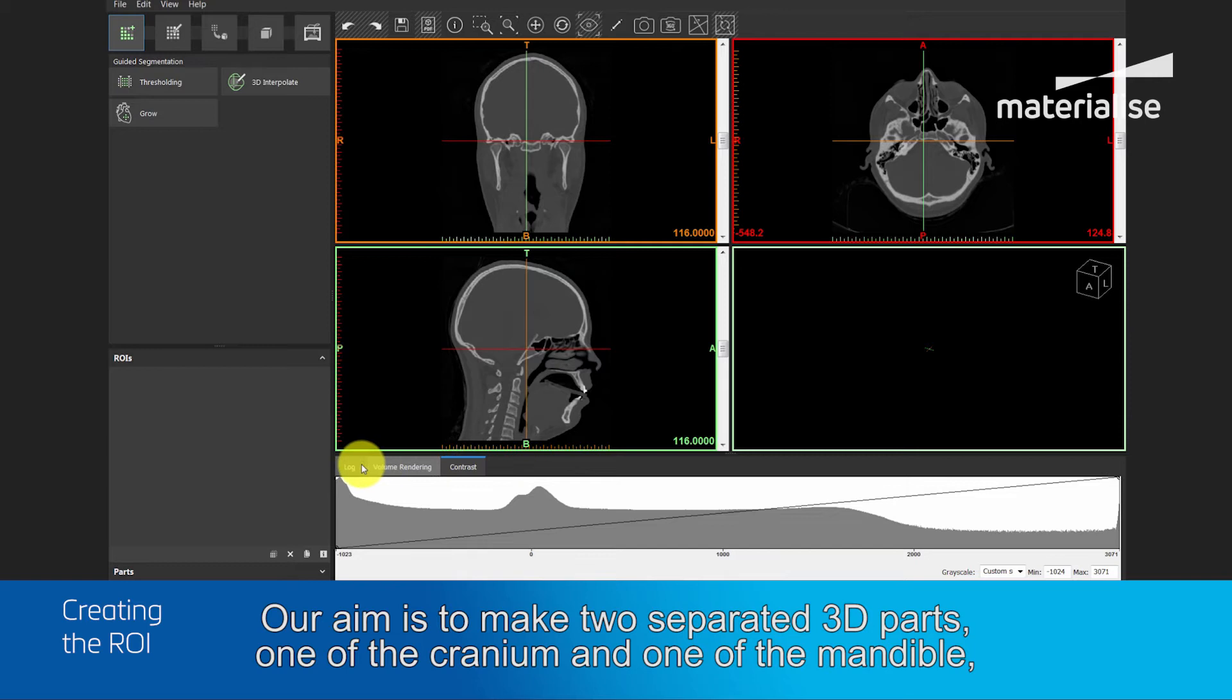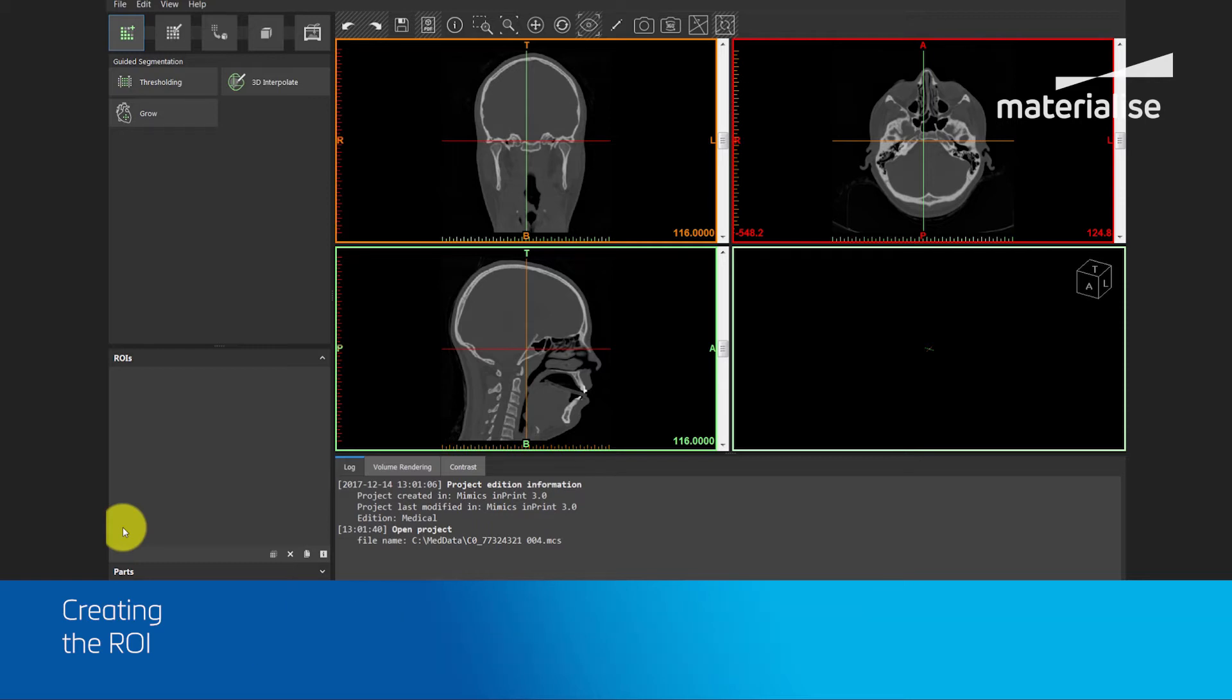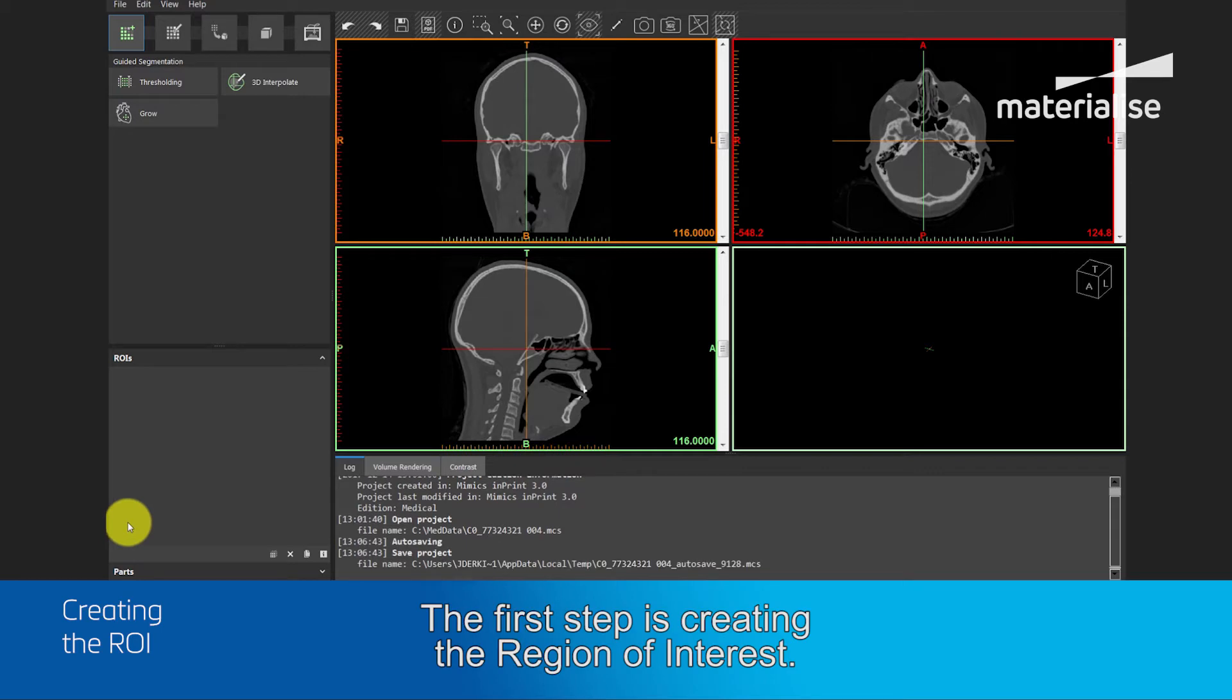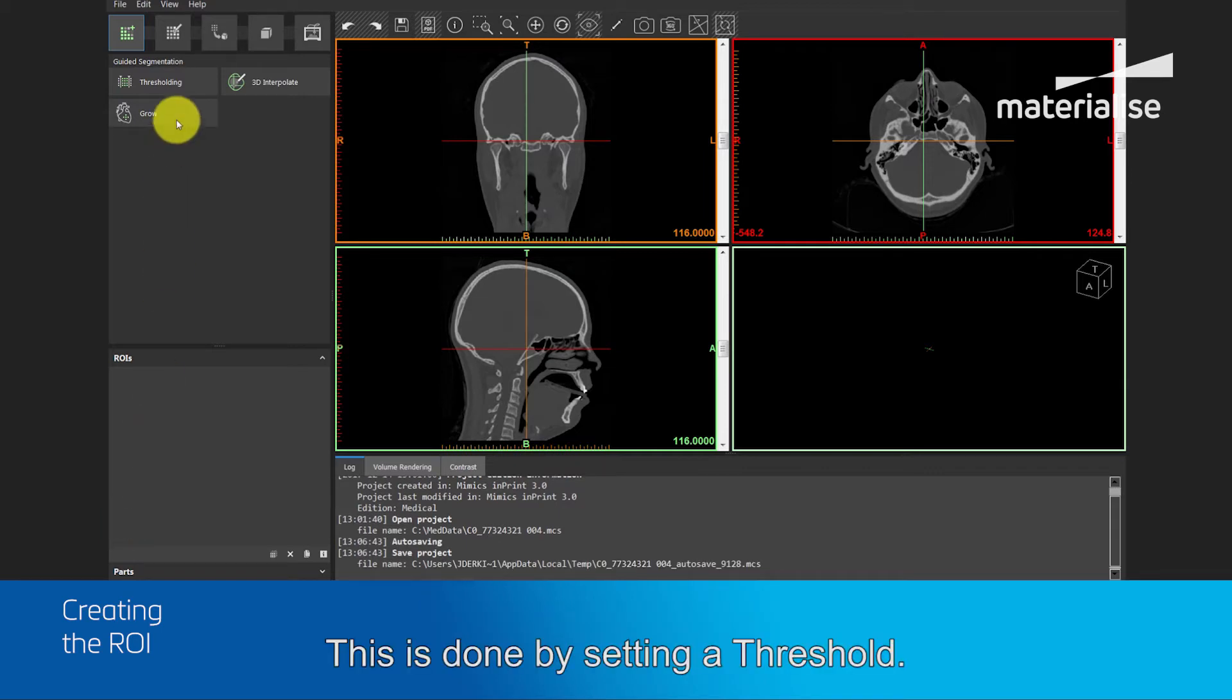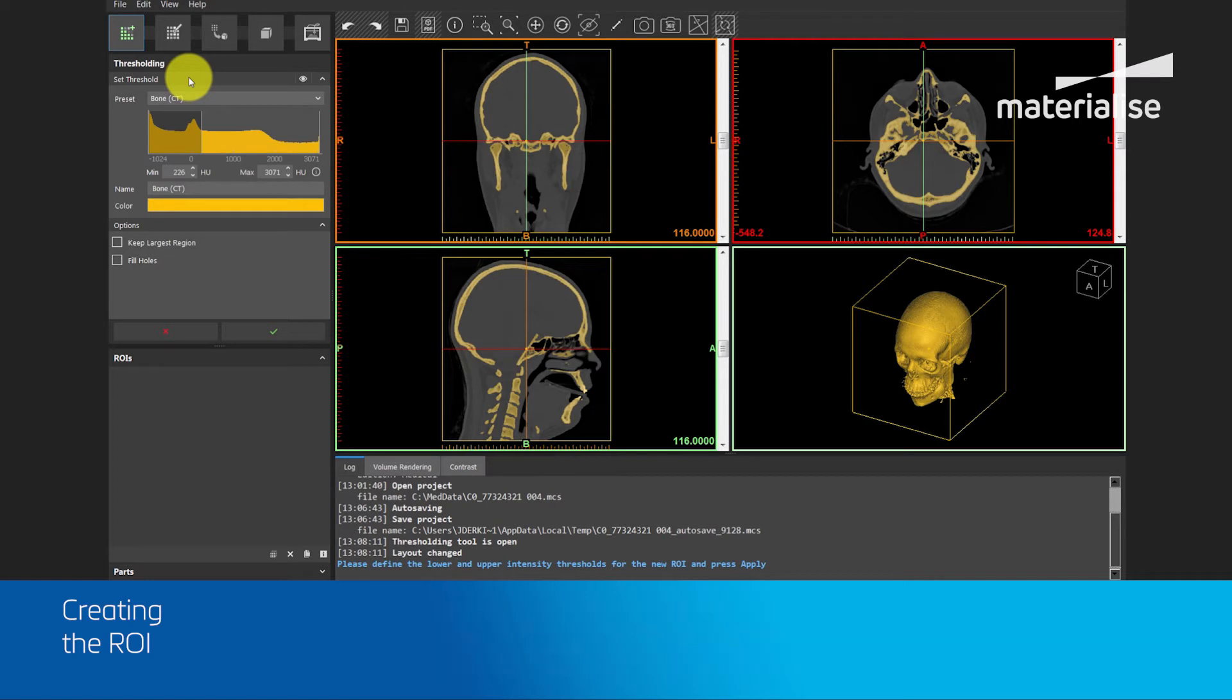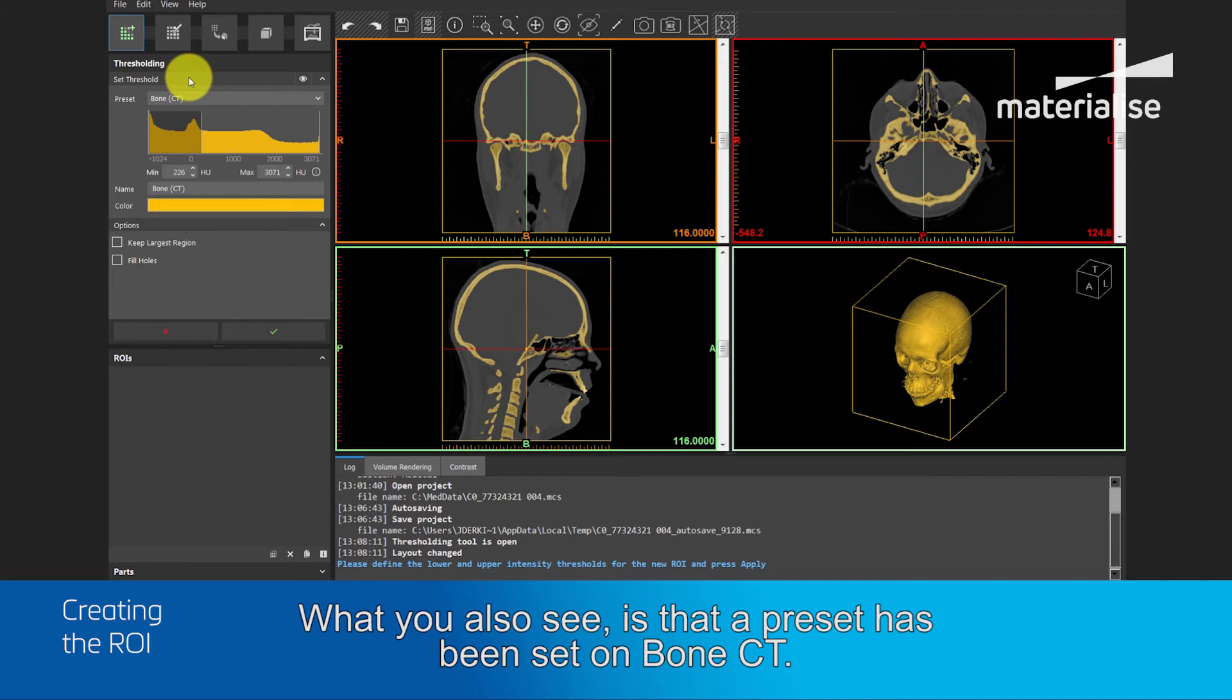Our aim is to make two separated 3D parts, one of the cranium and one of the mandible, which we can use afterwards for further surgical planning. The first step is creating the Region of Interest. This is done by setting a threshold. What you can immediately notice is the 3D Preview image created in the lower left viewport, which is not yet a 3D model.